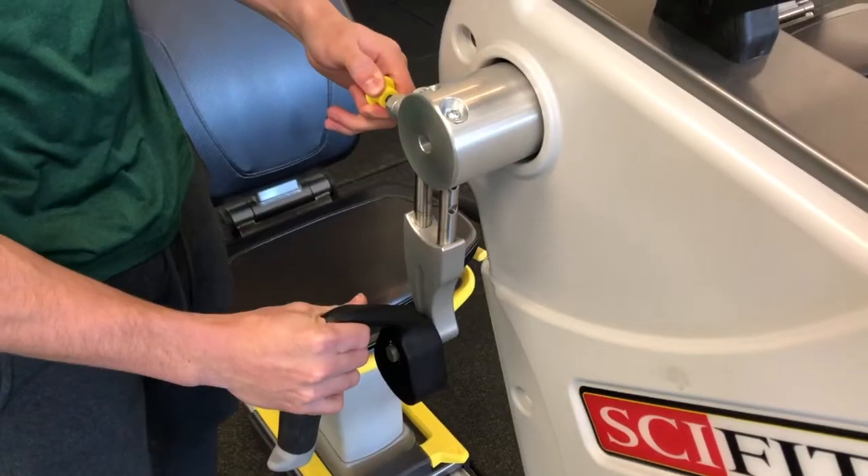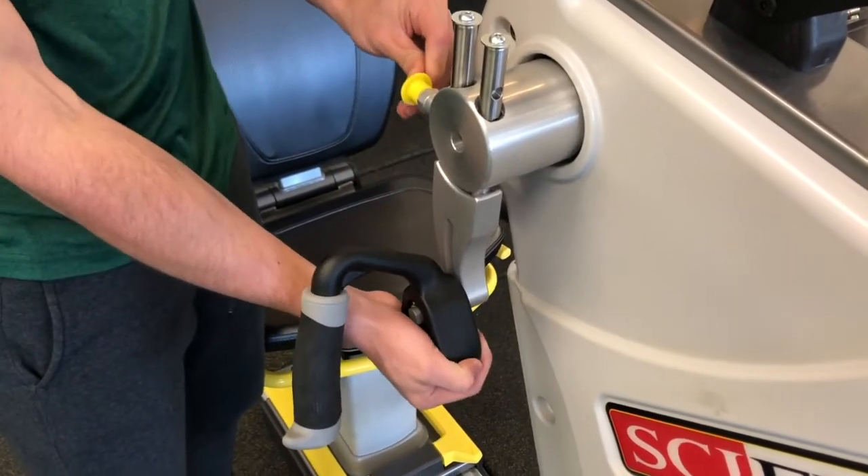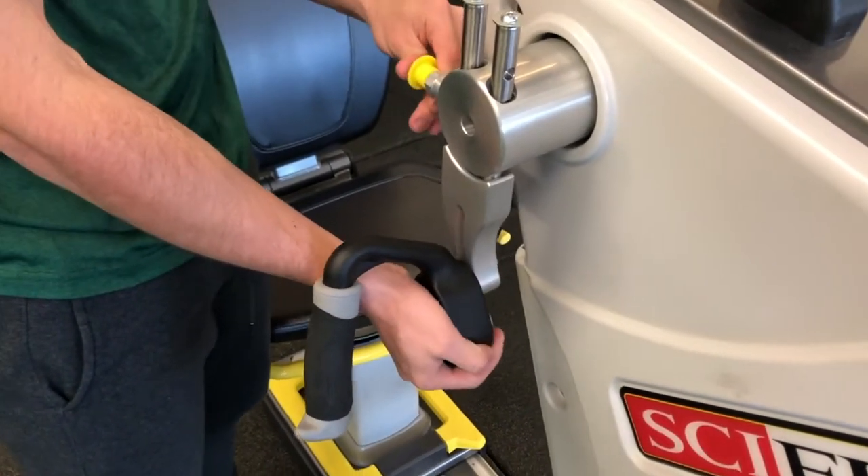Arm crank length should allow for a slight bend at the elbow at the furthest range of motion. You can adjust this by pulling out the yellow prong and sliding the handle up and down.